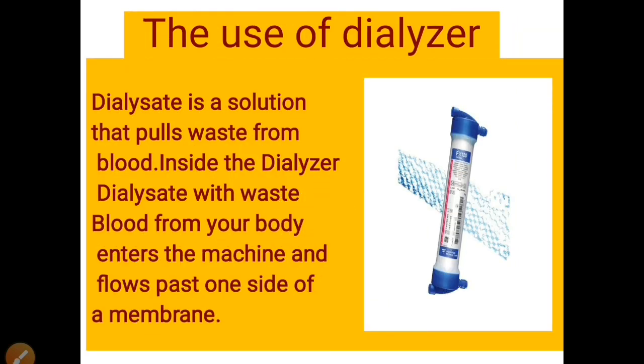Now we will learn about the dialyzer. How does it work? A dialyzer is a device that pulls waste from the blood. Actually, it's the main part of a dialysis machine. It helps in cleaning the blood.